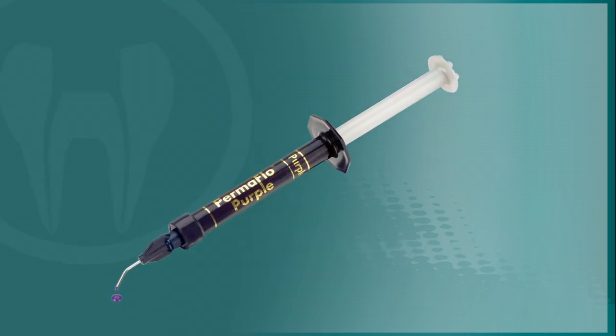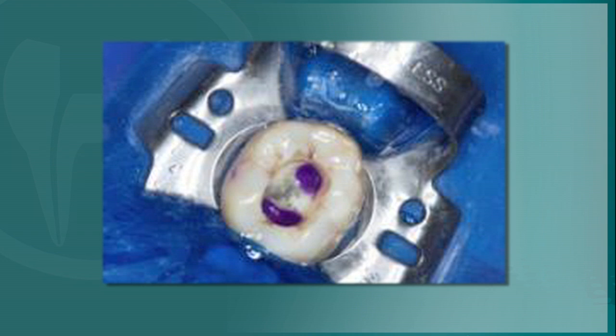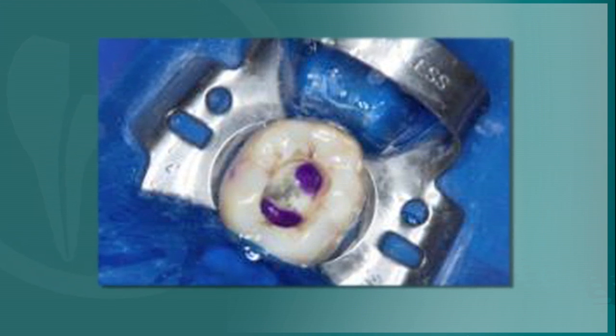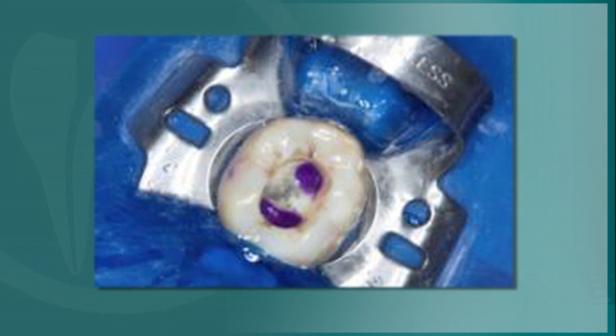Permaflow purple or another flowable resin should be used to seal the floor of the pulp chamber. The purple color of Permaflow purple simplifies locating the canal access should future therapy be needed, and will help to prevent damage to the seal and pulp floor.